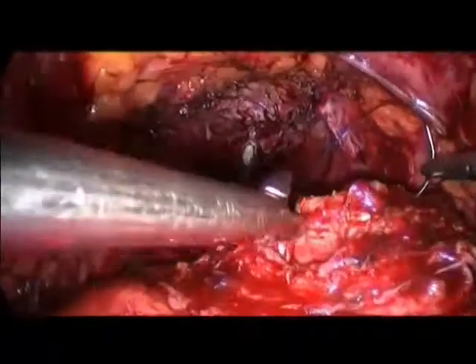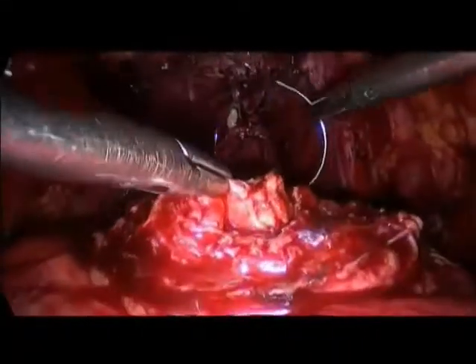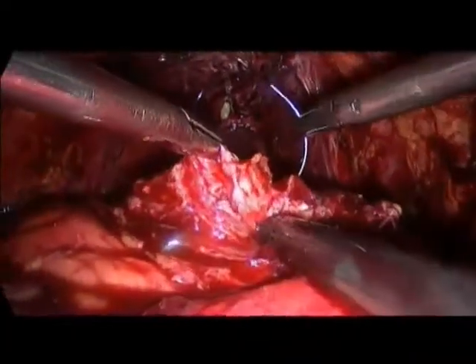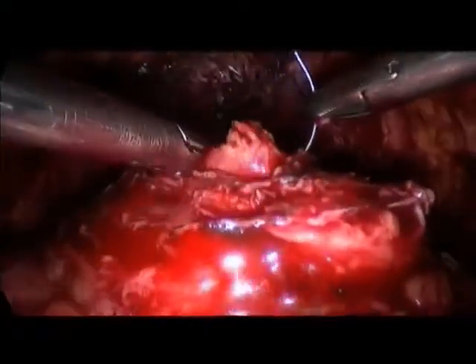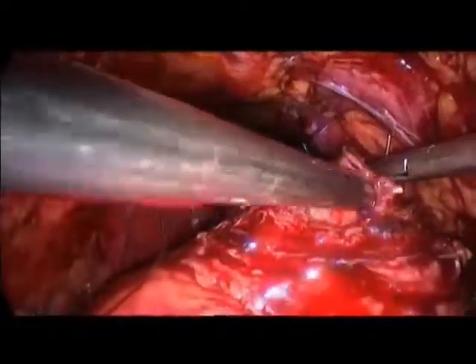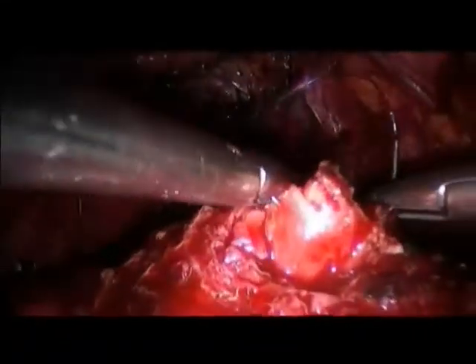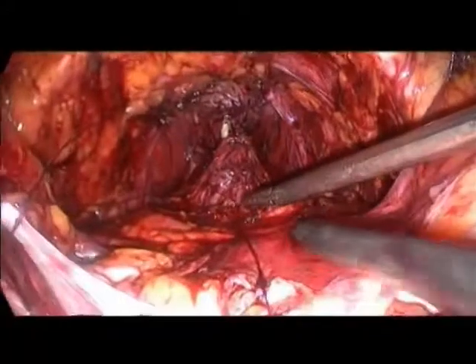Roland, we have some questions about the posterior aspect of the bladder neck. Some people are wondering if there is not some prostatic tissue here. No, I don't think so. You have it just in front of you. It's the posterior lip, and it's quite smooth, and there is no other tissue there. We had a very clear landmark for dividing it. I have no doubt about it here.